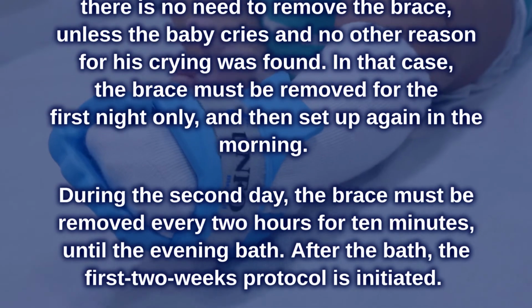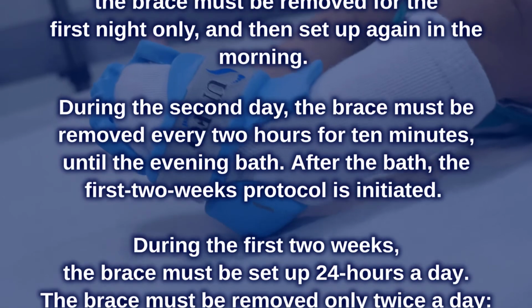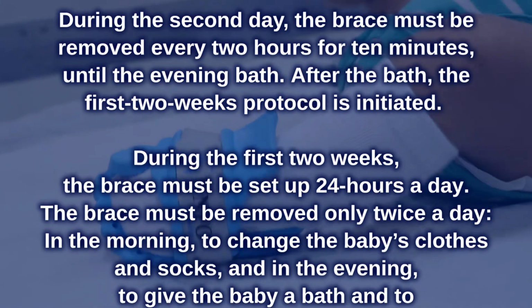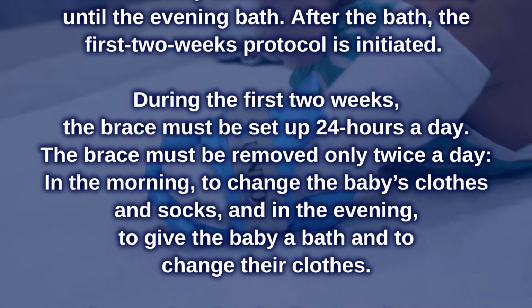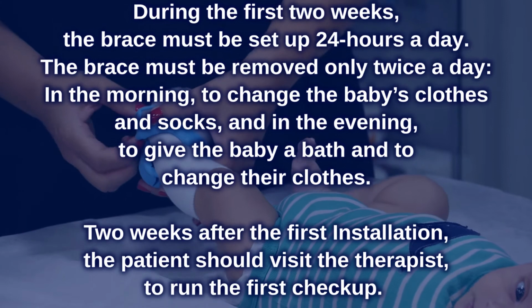During the second day, the brace must be removed every 2 hours for 10 minutes until the evening bath. After the bath, the first 2 weeks protocol is initiated. During the first 2 weeks, the brace must be set up 24 hours a day. The brace must be removed only twice a day, in the morning to change the baby's clothes and socks, and in the evening to give the baby a bath and to change their clothes.